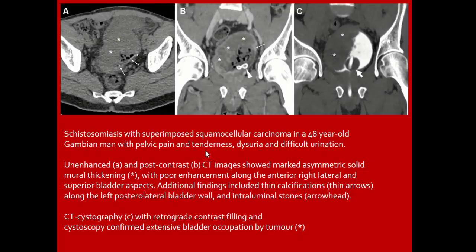Schistosomiasis with superimposed squamous cell carcinoma: unenhanced and post-contrast CT shows marked asymmetric mural thickening with poor enhancement along the anterior, right lateral, and superior bladder aspect. Additional findings include thin calcification in the left posterolateral bladder wall and intraluminal stones. CT cystography with retrograde contrast filling shows extensive bladder occupation by tumor.